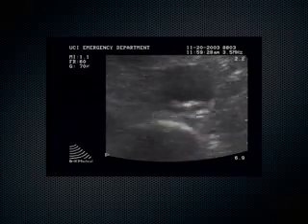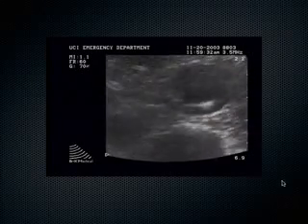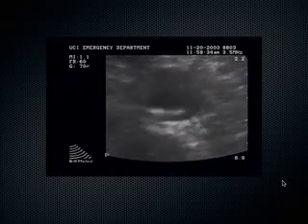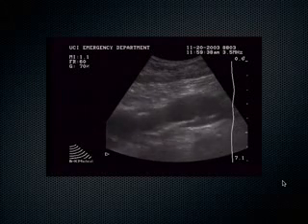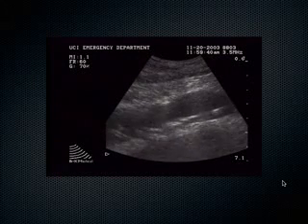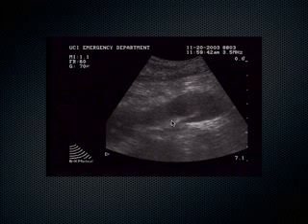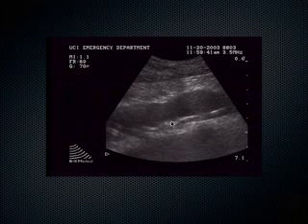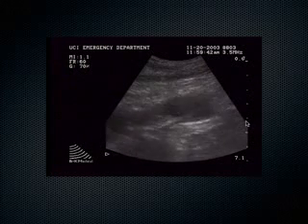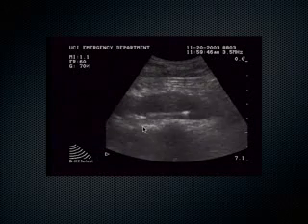What's this diagnosis? Here's the spine shadow right here. We've got it zoomed. Our depth is pretty decreased. What do you think's going on here? We're in the sagittal plane now. Pay close attention to this line right here. Why is it fluttering? What is that? How do you describe this? It looks like a valve. It looks like a big valve. Now, arterial structures don't have valves. Only veins do. So what the heck is this?